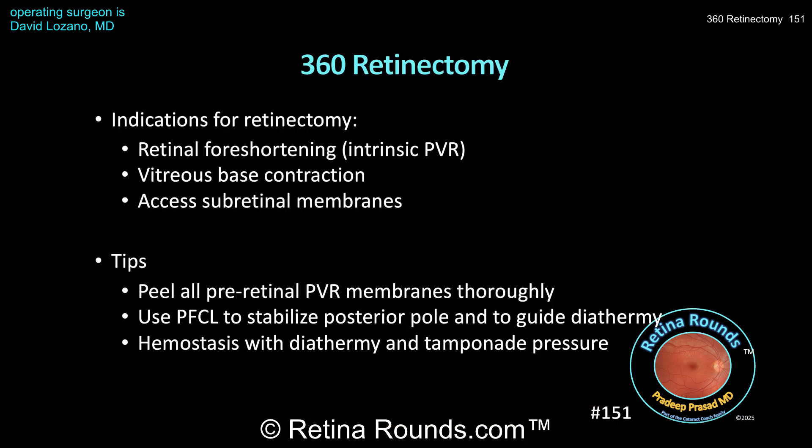Here are some take-home points. Peripheral retinectomies are sometimes necessary to address tractional forces from PVR. In patients with intrinsic PVR, where the PVR is within the retina, there can be retinal foreshortening, and the only way to reattach the retina is to perform a retinectomy so that the shortened retina can conform to the posterior surface of the globe. In other cases, the vitreous base may contract, shortening the retina or opening new retinal breaks. The vitreous at the vitreous base is integrated with the underlying retina, and so when there's significant PVR involving the vitreous base, shaving and peeling maneuvers alone may not be sufficient, and a retinectomy must be performed posterior to the vitreous base to effectively disinsert the posterior retina from the anterior retina integrated with the vitreous.